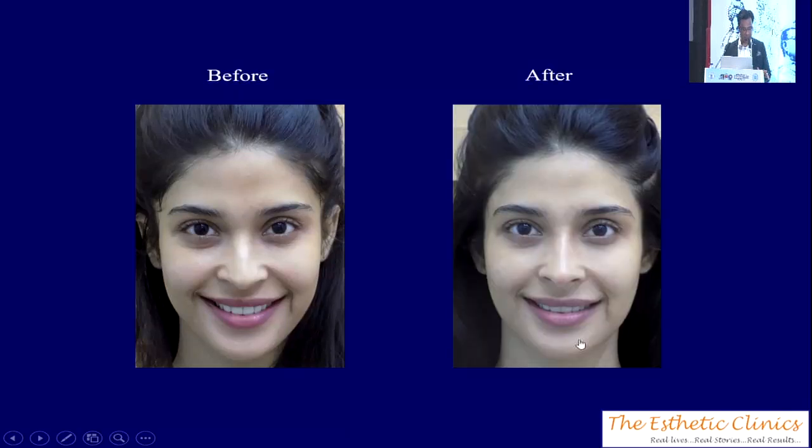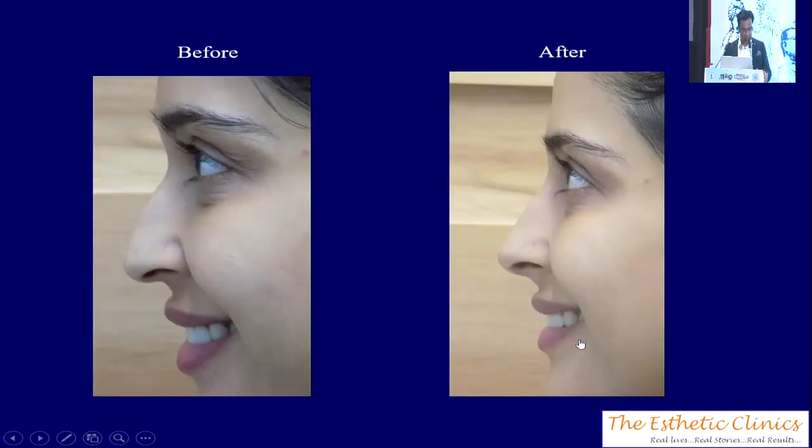You see, she's got a nice nose. But the moment she smiles, you can see how that nose drops down. Using fillers, using threads, etc., you can transform the angle also. This is something which if we were doing a surgical rhinoplasty, we would need a columella strut graft. And we've been able to achieve it without a strut because of the way we use high G' fillers, etc.